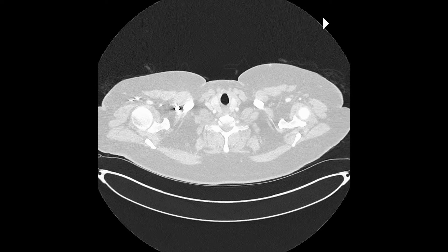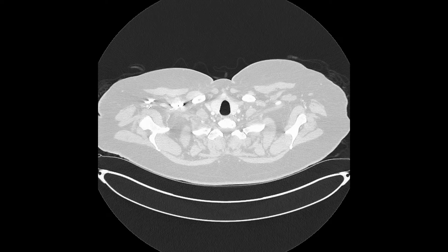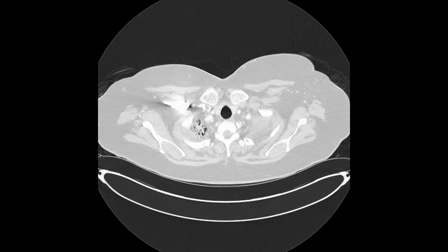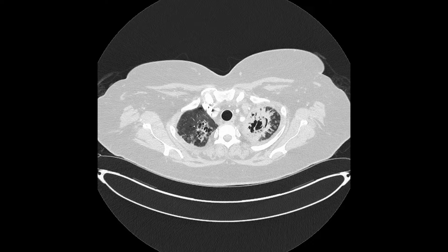To orientate ourselves, the CT scan is going through the entirety of the chest beginning from the head downwards.